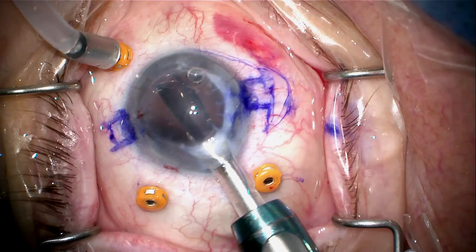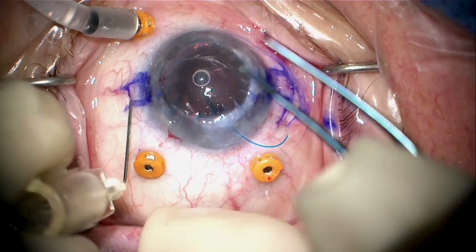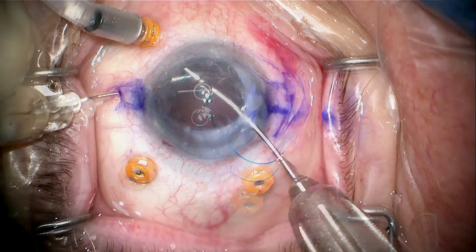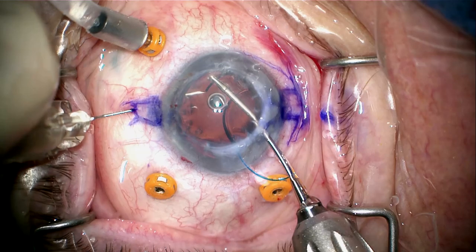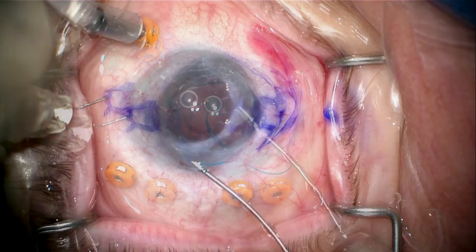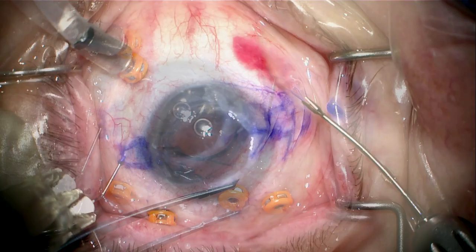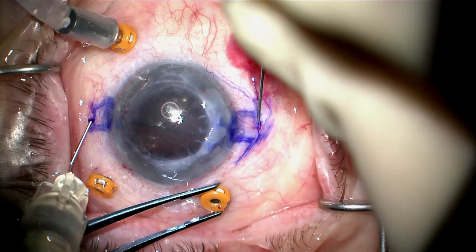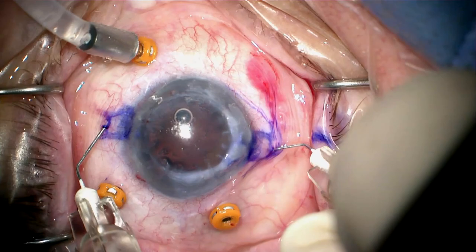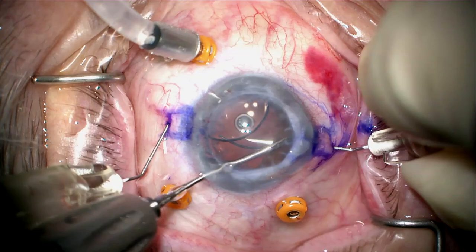I'm going to be using an AR-40 for this — it can be a little tricky to dock the haptics, so I need a good view. Here we're marking the eye with an Agarwal marker. I'm going to inject my AR-40 lens into the anterior chamber on top of the iris. Using a 30-gauge TSK needle, I want to make reasonably long scleral tunnels so they'll be nice and secure when I remove the cornea.